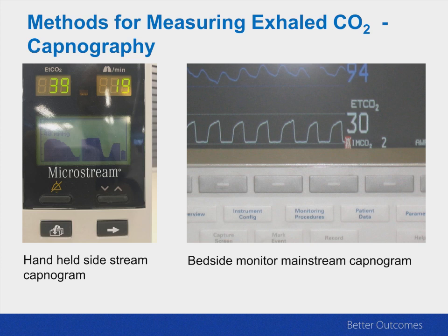So what we want to do is, again, look at how we would apply capnography. And I want to show you again how simple this is to do.